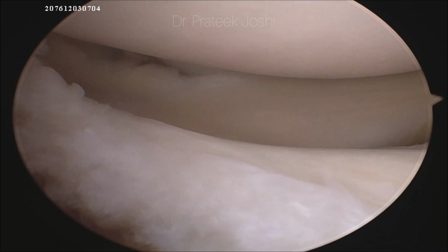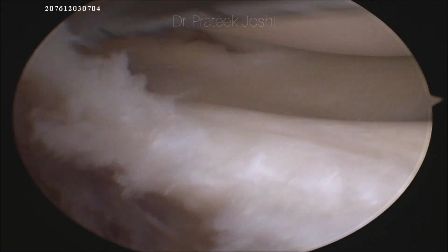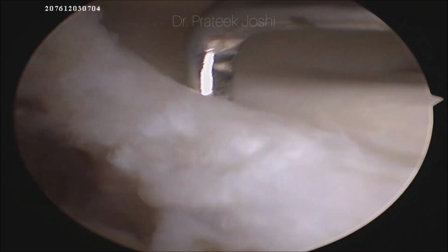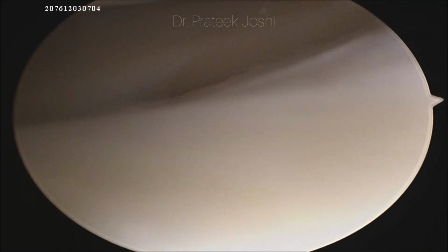Today we have a case of a young individual with lateral meniscus, anterior horn and body tear leading to parameniscal cyst formation. As you can see on the diagnostic arthroscopy, there is complete tear of the anterior horn and the body of the lateral meniscus at meniscocapsular junction.